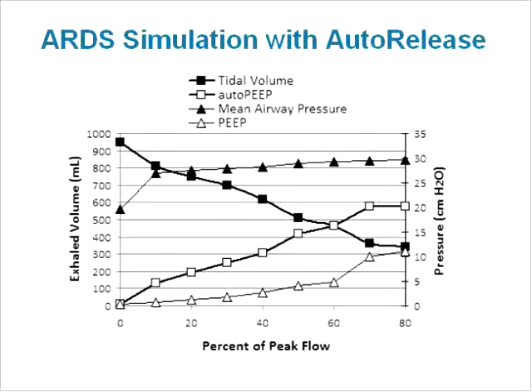Using Habashi's suggested inspiratory trigger thresholds of 50 to 75% peak expiratory flow in this model resulted in tidal volume changes ranging from 345 to 510 milliliters and auto-PEEP from 15 to 20 centimeters of water. Expiratory times from 0.27 to 0.48 seconds resulted in tidal volumes ranging from 348 to 846 milliliters and auto-PEEP from 3 to 20 centimeters of water.